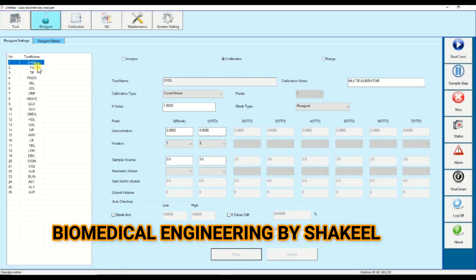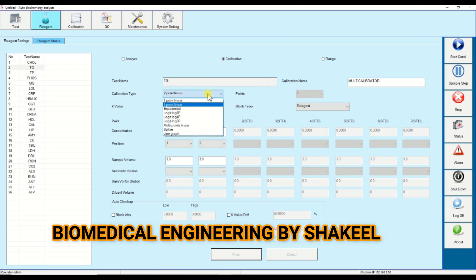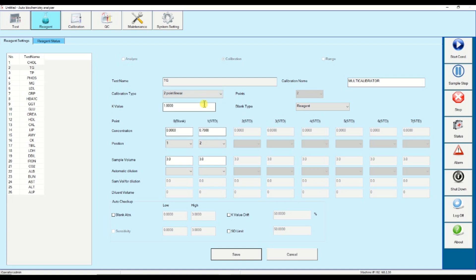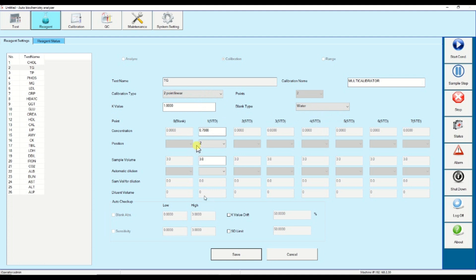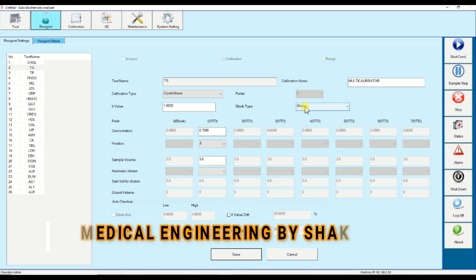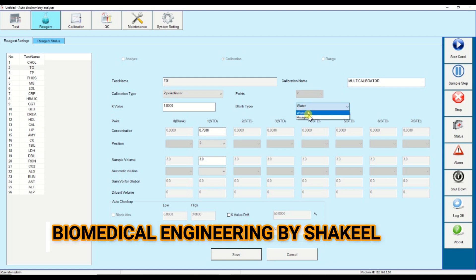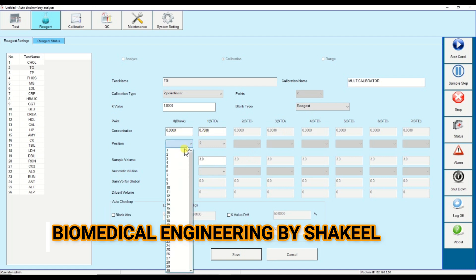Now it's time to enter the calibrator value. Click on parameter, then select the calibration type — it could be one-point linear or two-point, depending on the parameter. Then select the blank type: reagent or water. If you select water, no need to keep the blank — only one calibrator is enough. But if you select the blank type as reagent, you have to keep the blank as well, and after that assign the position.